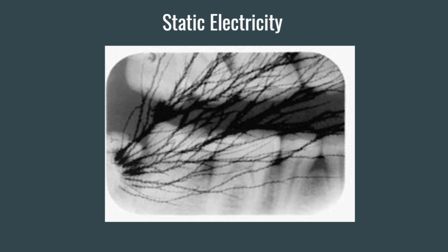Or you know how when you walk across carpets sometimes and then you touch something and it zaps you or you zap somebody else? You can do that to the film essentially. If you are in a carpeted area and then you touch the film and you haven't touched anything to reduce that static electricity, your film will come out looking like this.